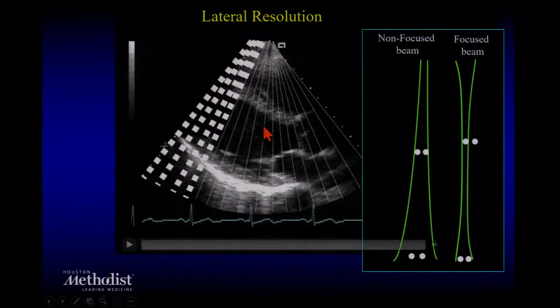Now, the other one is lateral resolution. So it's the ability to differentiate two dots in the lateral portion as opposed to the axial portion of your emanating beam. Something you can do nowadays, as you saw with these beams here, is you could focus them.